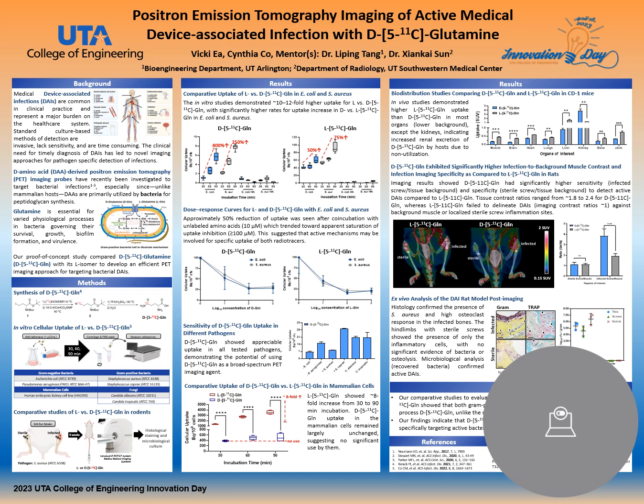Finally, we prepared a rat infection model using steel screws as an implant, and the PET images showed high sensitivity for the D-glutamine at the infected site, while L-glutamine did not. Histological analysis confirmed the presence of bacteria at the infected site, while the sterile site only showed inflammation.